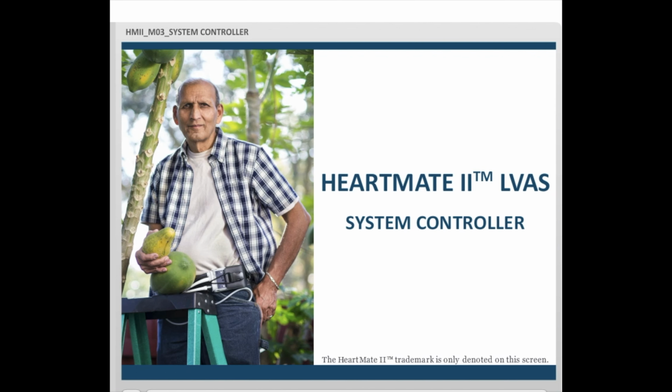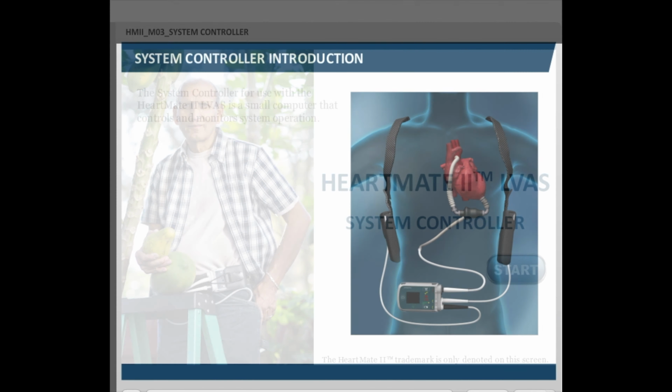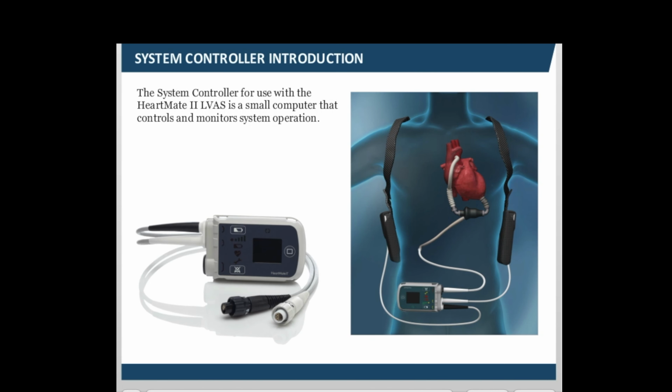LVAD, left ventricular assist device, HeartMate 2 system controller. The system controller for use with the HeartMate 2 LVAS is a small computer that controls and monitors system operation. It connects to the HeartMate 2 left ventricular assist device, or LVAD, via the driveline that passes through the patient's abdomen. The driveline sends power and operating signals from the system controller to the HeartMate 2 LVAD, frequently called the pump. It also transmits information from the pump to the system controller.